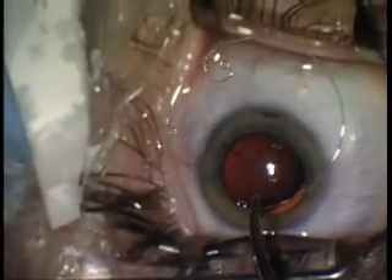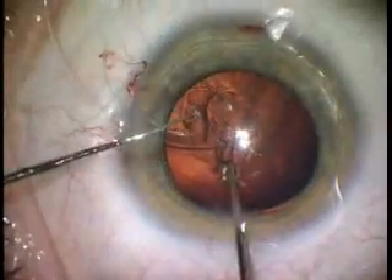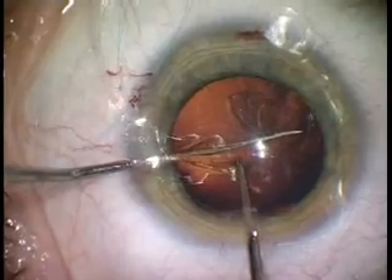Since the introduction of the modified capsular tension rings by Dr. Cionni, they became increasingly important in the management of profound zonular weakness during cataract extraction. Joined to the ring is a fixation element or hook which extends centrally and is designed to be positioned on the surface of the anterior capsular rim.